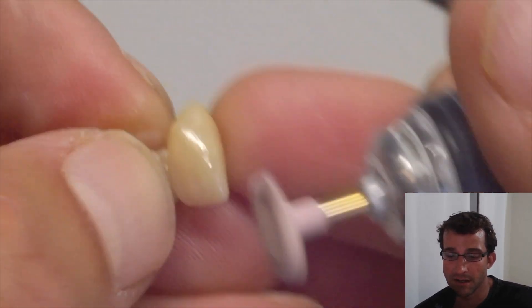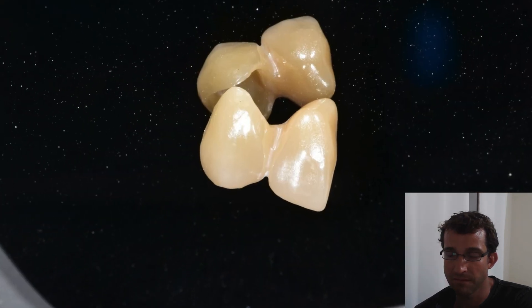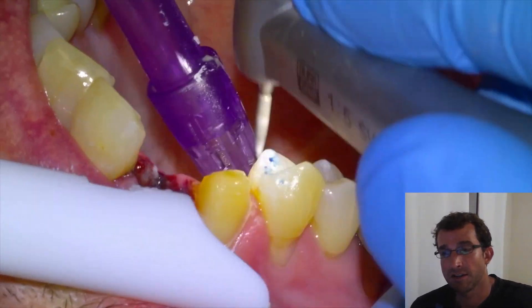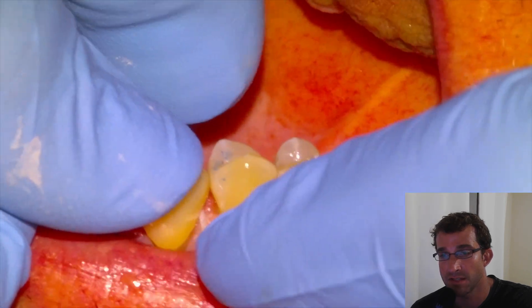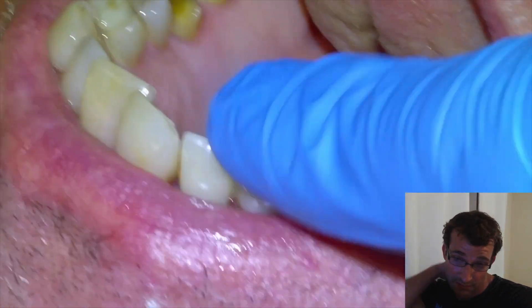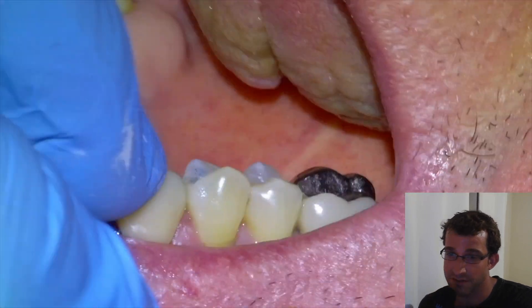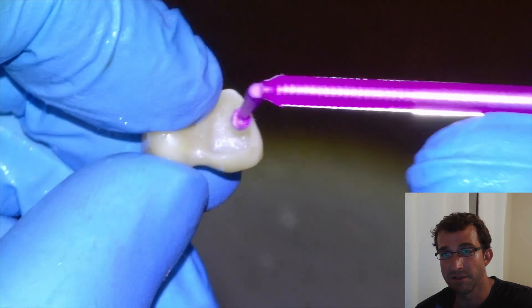There are two polishing steps — the second one is for fine polishing — and then it's ready to go. We'll get the patient back the next day. We temporized this case, so we'll flick the temp off. There's the macro of the unit. We tried it in and it must have had a tight contact, so we're going to take a flame and relieve the contact a little bit. Once we're happy with the interproximal contact, we'll check the bite. You don't want it too tight, otherwise it won't seat correctly.